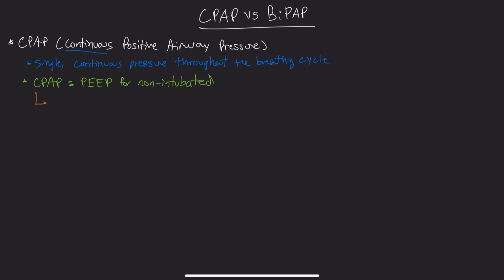So the benefits to the patient here, it's going to improve oxygenation, and it does this through preventing atelectasis. Remember, atelectasis is just alveolar collapse, right?